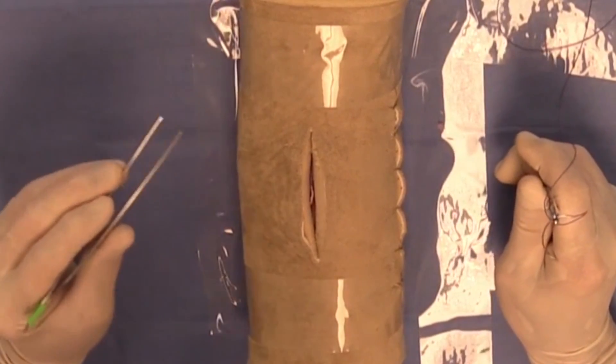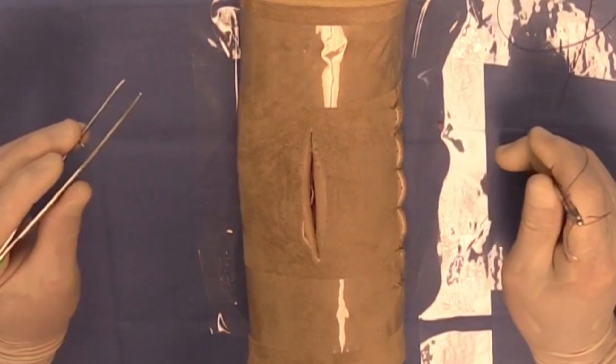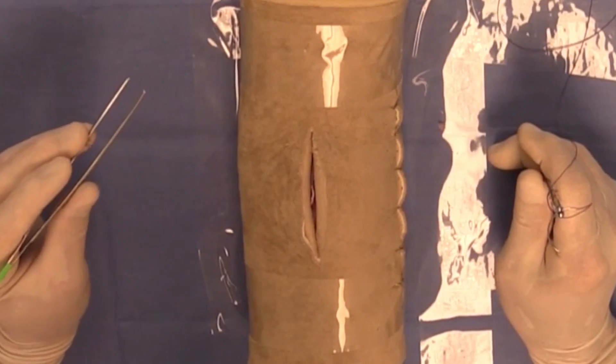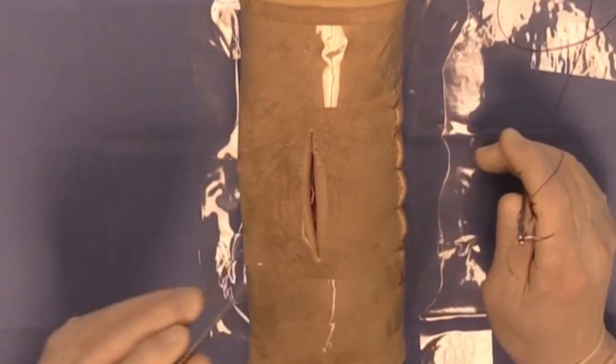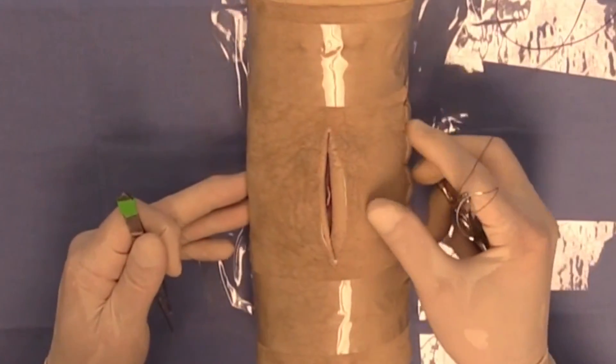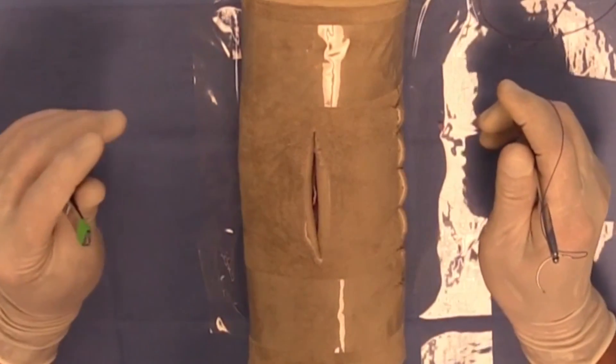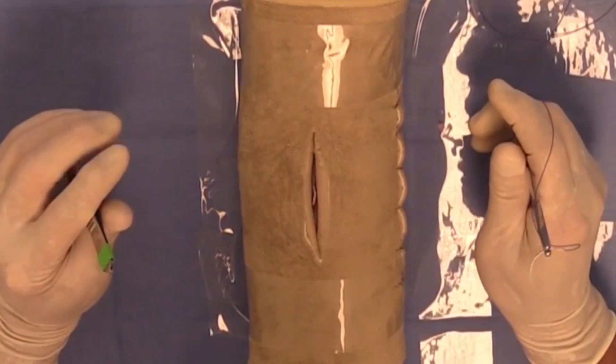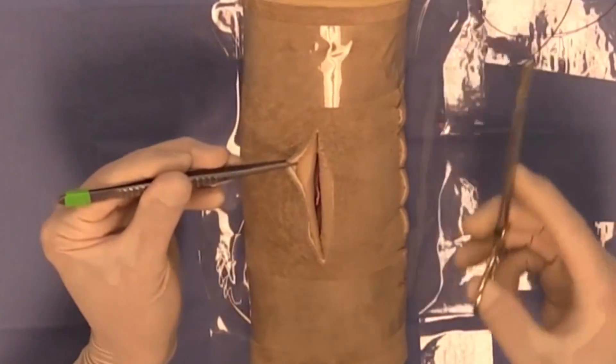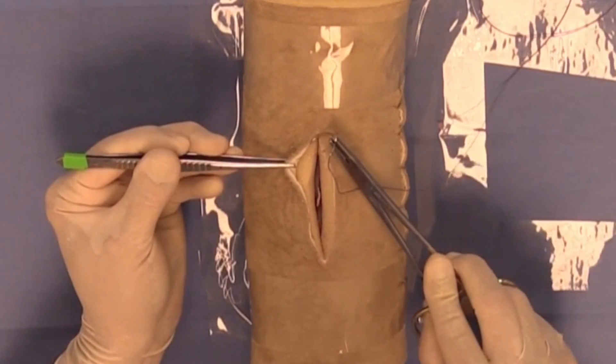There is always some controversy in trying to either understand or explain subcutaneous suture patterns versus subcuticular suture patterns. One of the problems we have in this course using the DAISY is that there really is no good way to demonstrate these subcuticular suture patterns because the subcuticular tissues really include the deep part of the dermis.